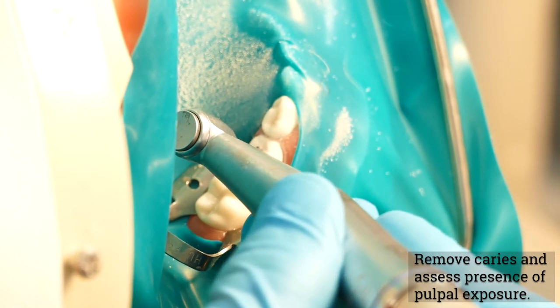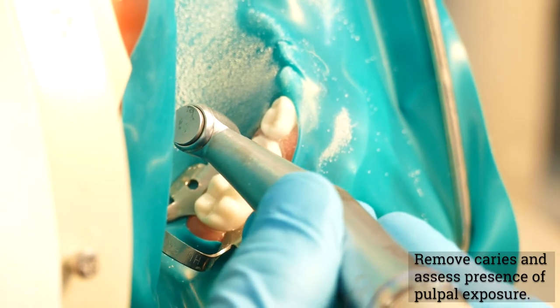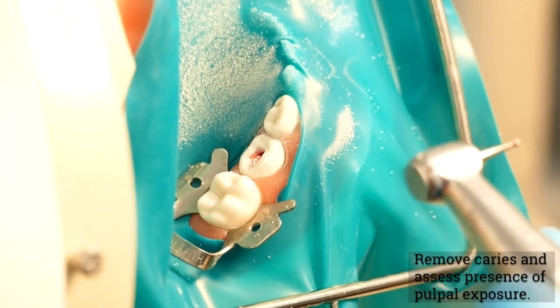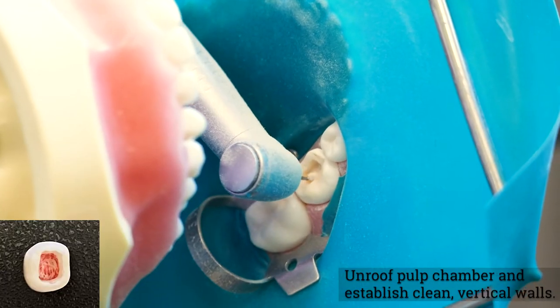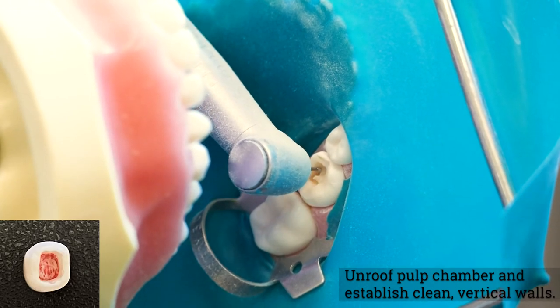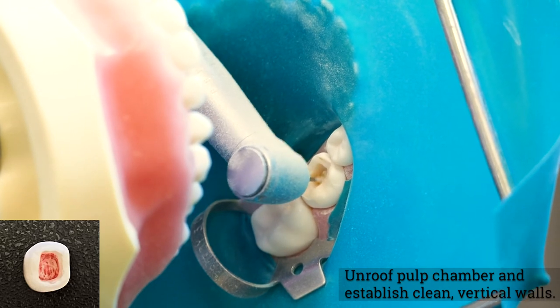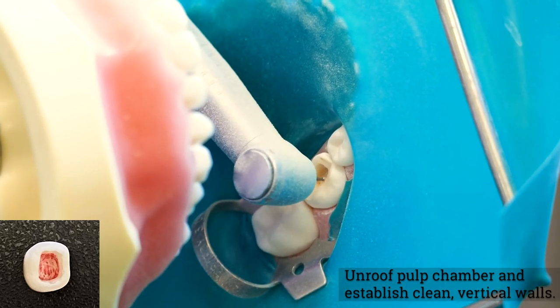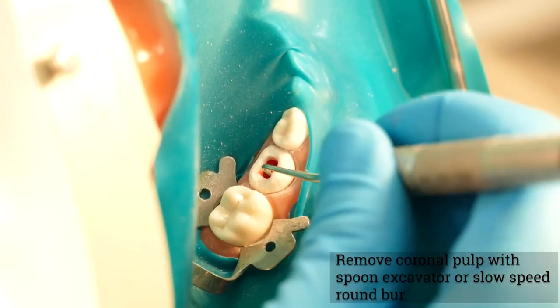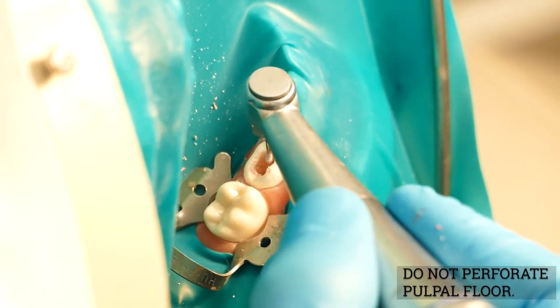Remove caries and determine presence of pulpal exposure. Carefully unroof the pulp chamber and establish clean vertical walls with a number 330 burr or a number 169 burr. Remove coronal pulp with a spoon excavator or slowly rotating number 4 or number 6 round burr with light pressure. Do not perforate the pulpal floor.